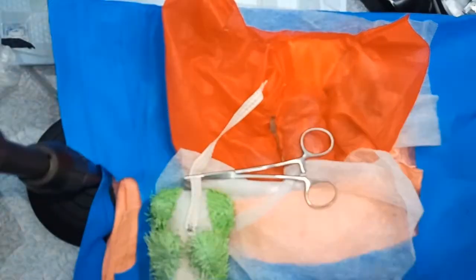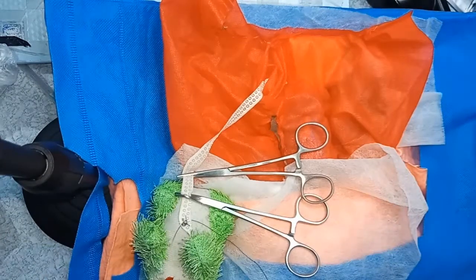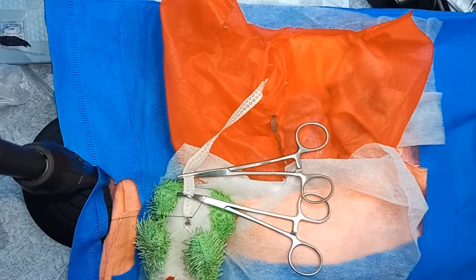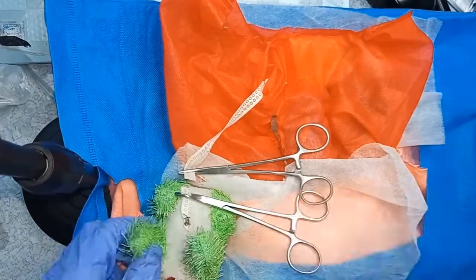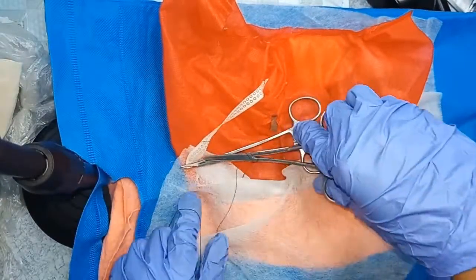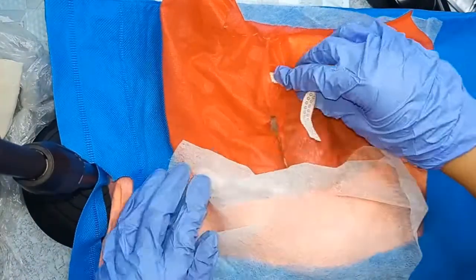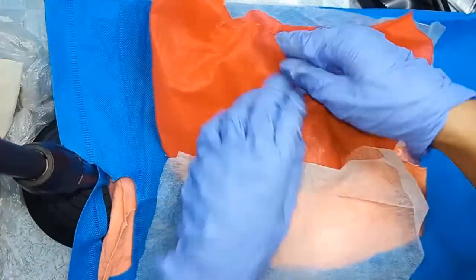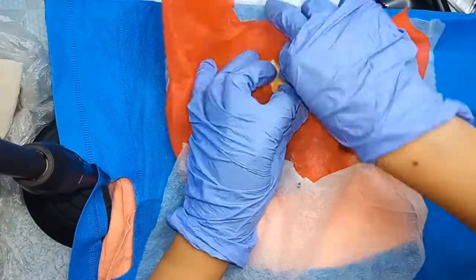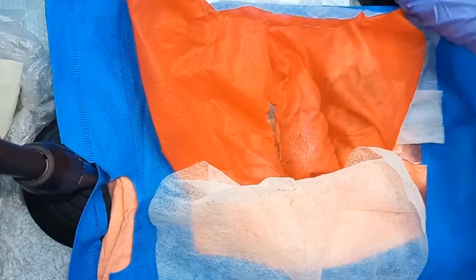The umbilical vessels are then clamped and severed approximately 2 to 3 cm from the fetal abdominal wall. This is then ligated. The neonate is placed on a sterile towel and is passed to an attendant. The associated placenta is then slowly removed from the endometrium by gentle traction to minimize hemorrhage. This procedure is repeated until all fetuses and placentas have been removed.